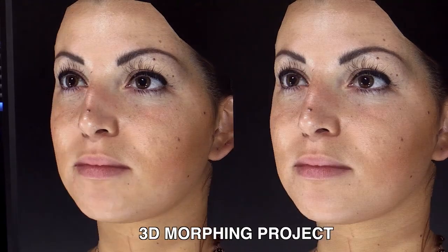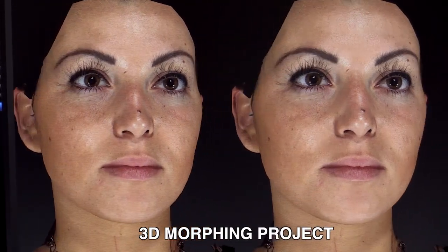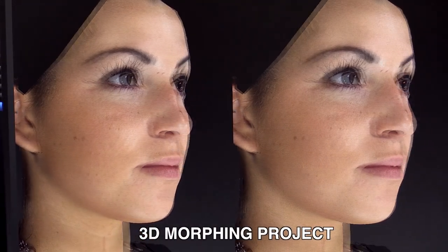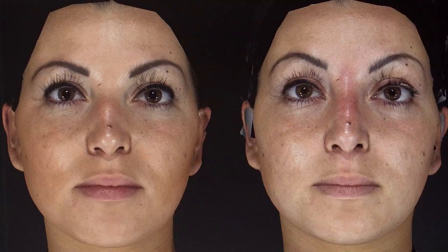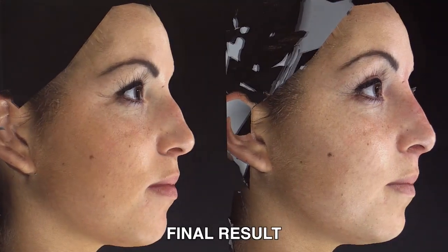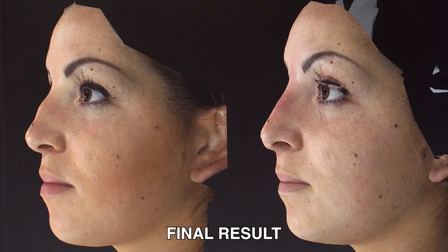That is the project on a morphing system on a 3D camera. We propose the patient accept the project because it's not a hump removal but a hump hiding with the gel, and then we can compare the immediate final result on the same 3D camera, a natural shape of the nose and a straight nose on the front view for patient satisfaction.